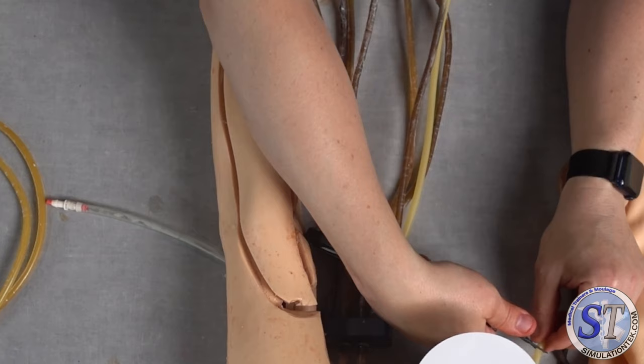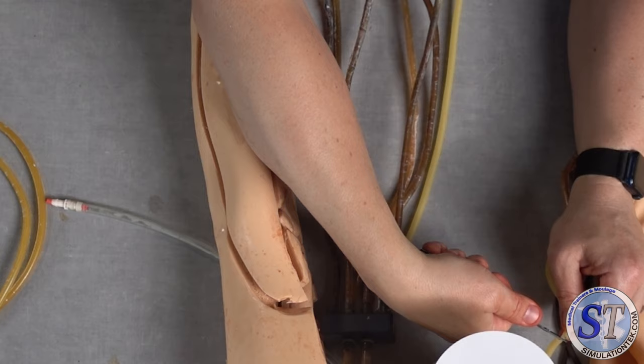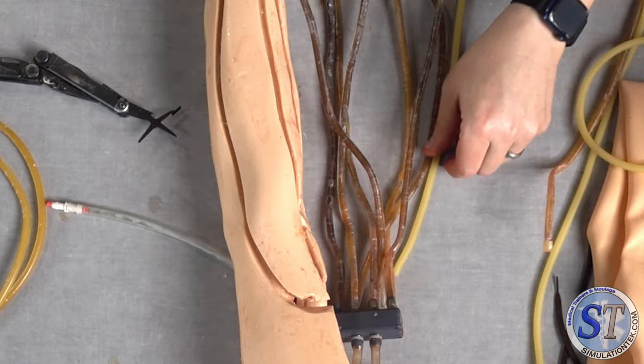I'll give myself just a little extra, and the reason is I'll put it in the pathways and then cut it off. If I have extra, I can cut it off. If I don't, I can't. Scissors I've got on my Leatherman. And try to cut it as straight across as possible. Maybe not the best scissors for this, but it worked. So I've got my first tube measured.